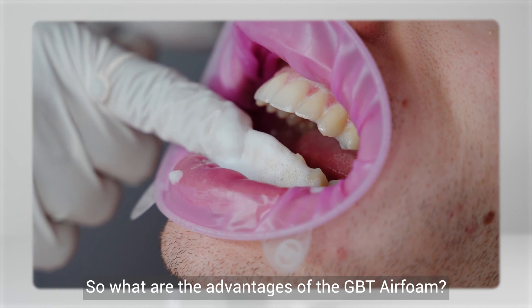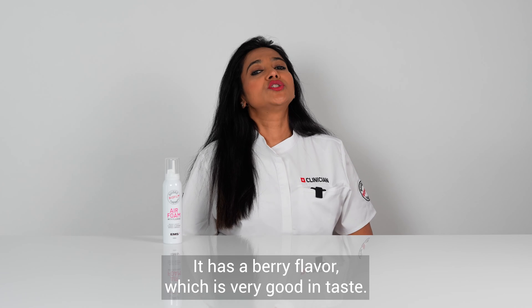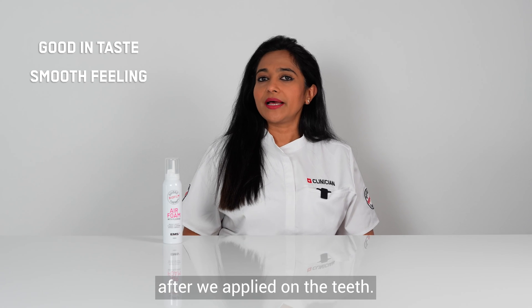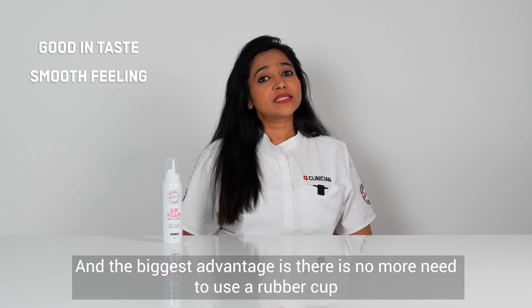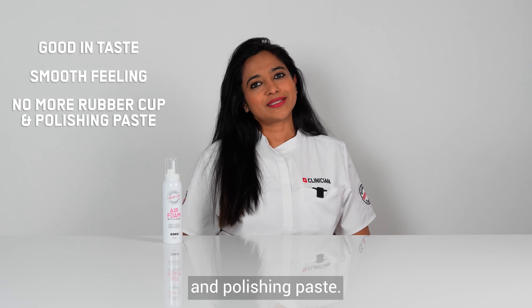So what are the advantages of the GBT Air Foam? It has a berry flavour which is very good in taste, a smooth feeling after we apply it on the teeth, and the biggest advantage is there is no more need to use a rubber cup and polishing paste.